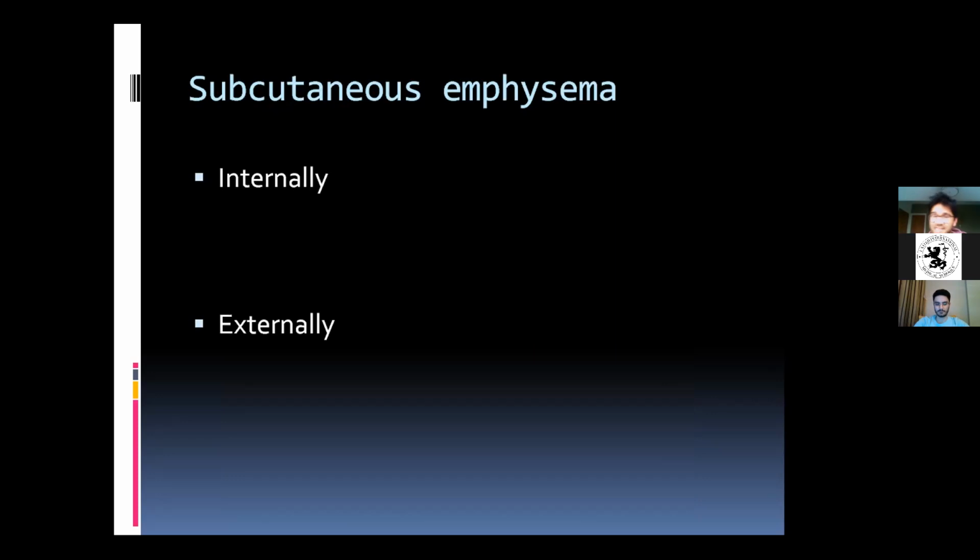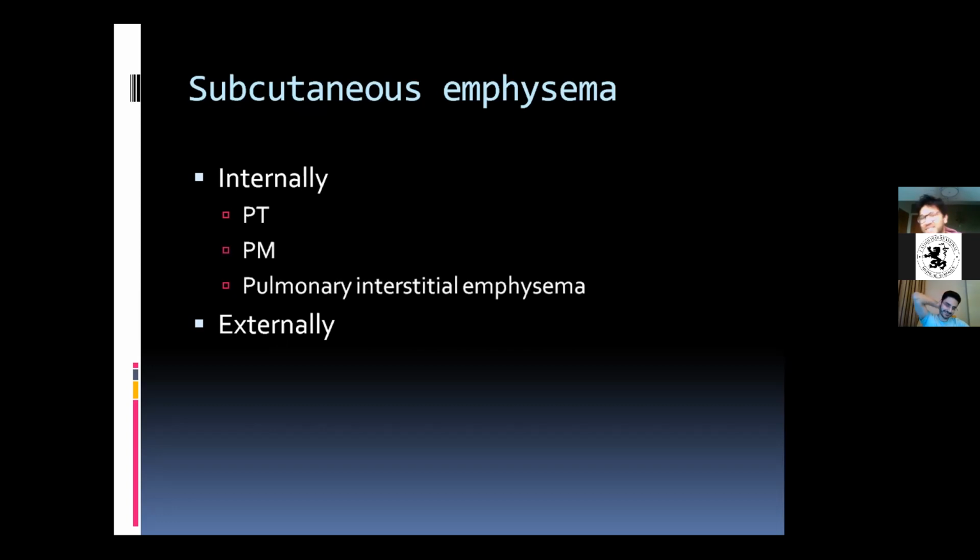Cancer. Is everything cancer? Common is common. Gliomas, all. Pneumothorax, there we go. Pneumothorax, pneumomediastinum, pulmonary interstitial emphysema.